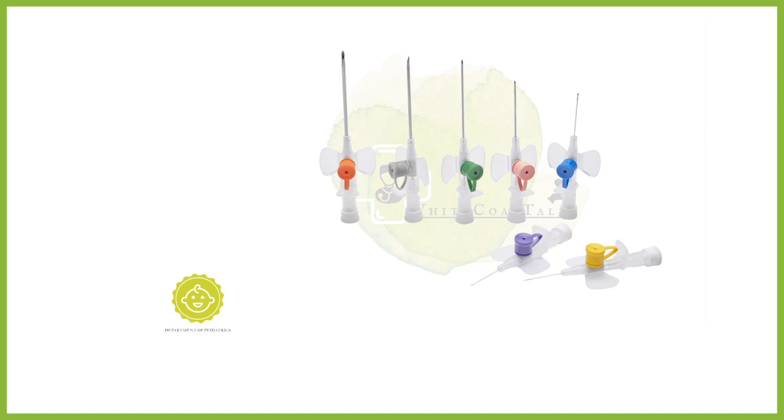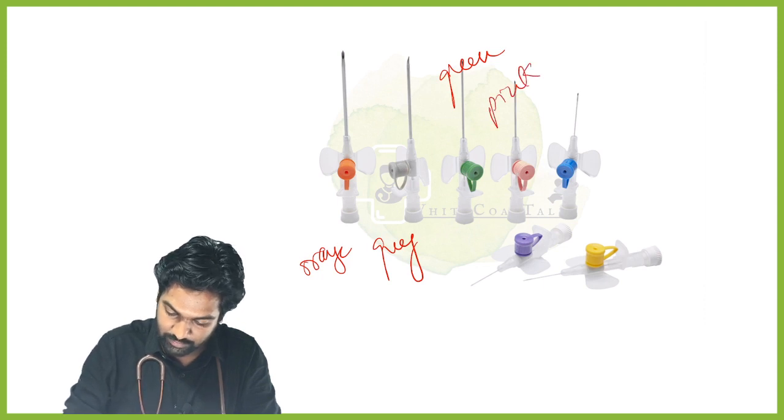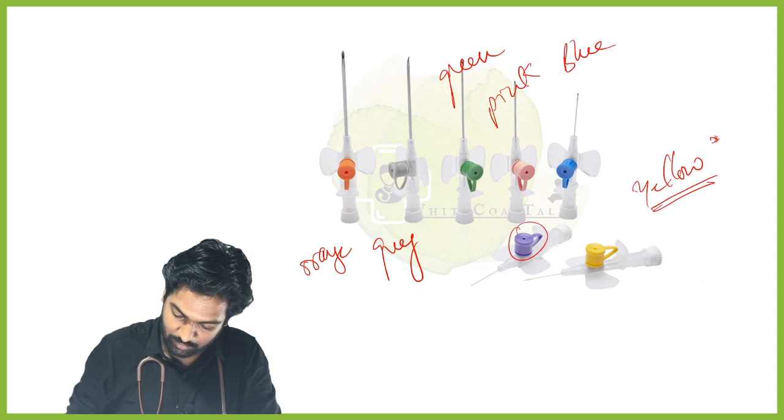So as a layman, you got to know that it was blue color. Here in the diagram, it is pink color. What are they? We'll see. You can see here multiple different types of cannulas. This is orange, gray, then this is green. This is pink. This is blue. Yellow is the smallest one. Even smaller than this you can get. This is purple, smaller than that.